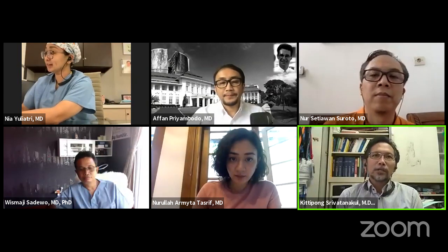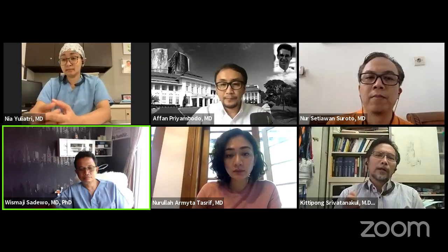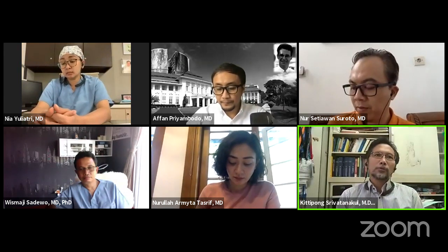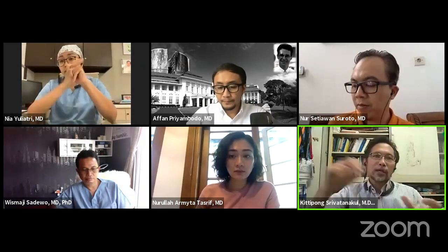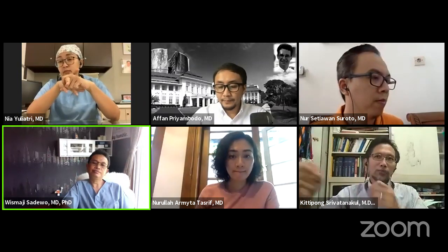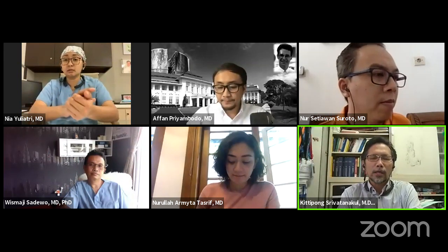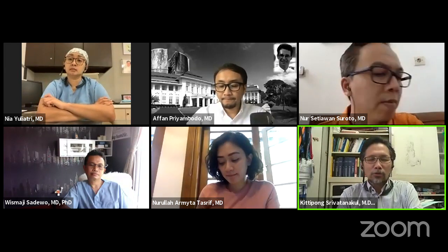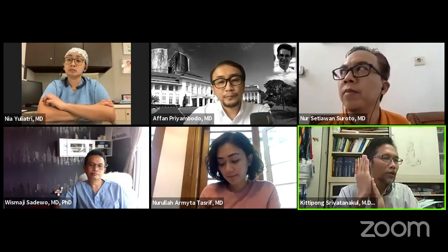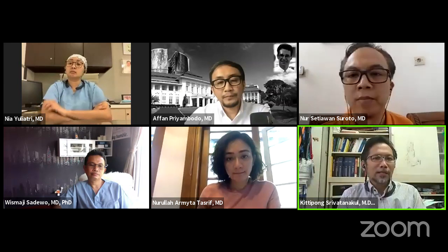And I think the best way to do this is to try to draw yourself. The illustrations I've given out to you, you can draw on them. You can make copies of them, draw on them, look at the angiograms, match that with the picture, and make your own drawings. It doesn't have to be a very nice drawing, but as with any language, it has to be practiced. So if you inject an internal carotid artery and you have an aneurysm at the MCA, don't look only at the aneurysm.